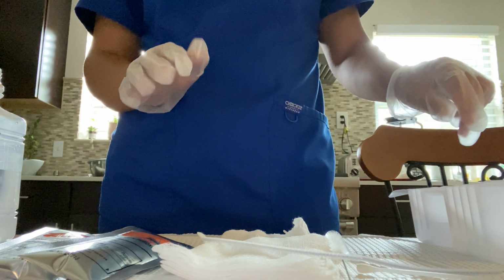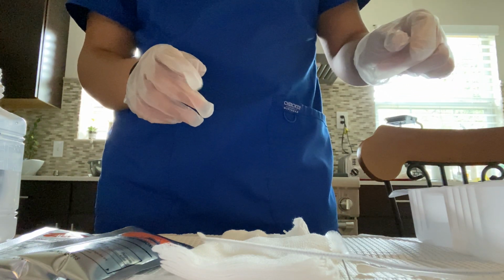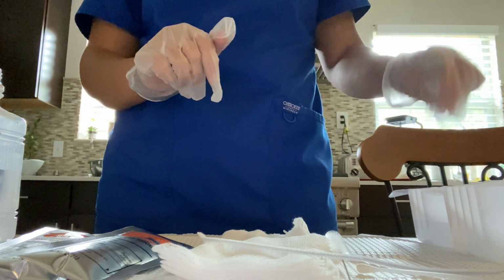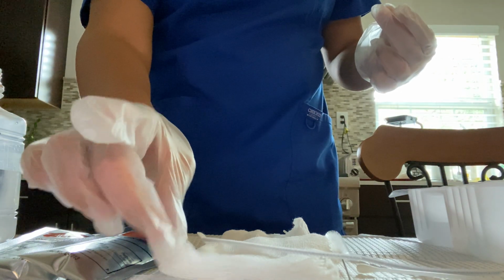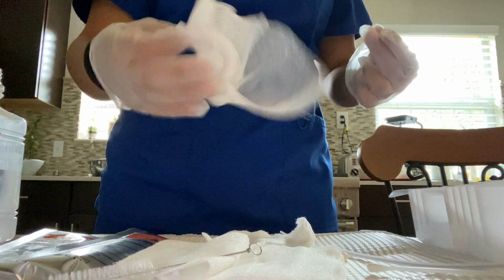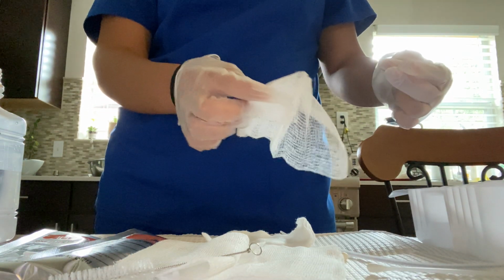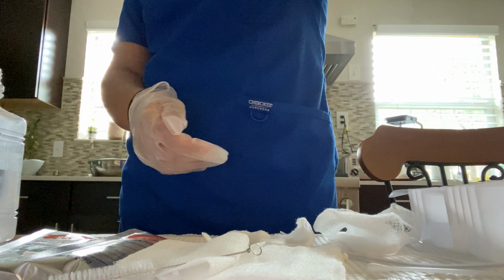And then now, with my sterile hand, I grab the tube to clean it, and then we throw that away. Then we put the trach in the other compartment, and then we grab it again with our dirty hand, and then we dry it off with our clean hand. Oh my God, I'm sorry, it's getting stuck everywhere. Then we just dry it off. This hand remains sterile and clean. This is my dirty hand with my trach in it. After that, we'll dry it off and place it back in with my dirty hand.